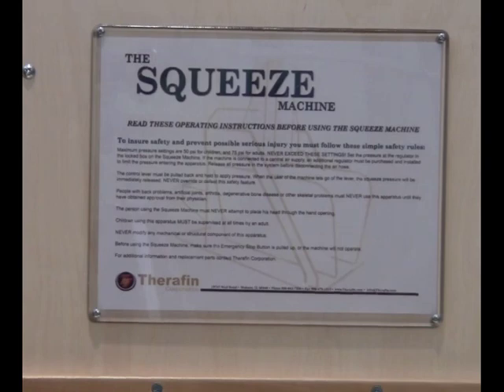Also, we want to make sure that the machine is adjusted properly, and that the machine is used with an individual accompanying a child. We want to walk through and very specifically follow these instructions.